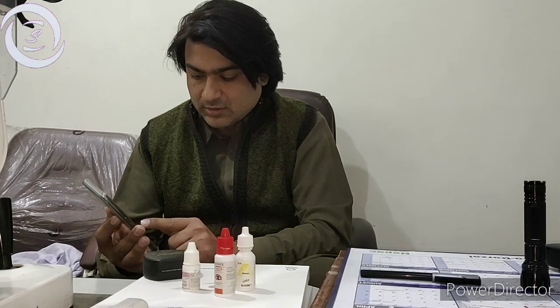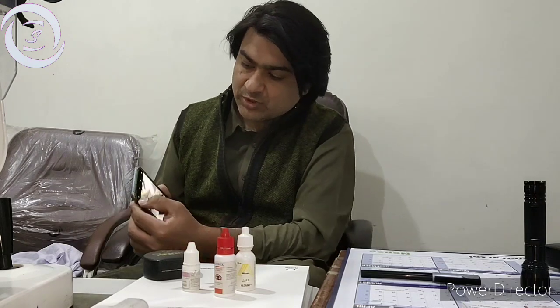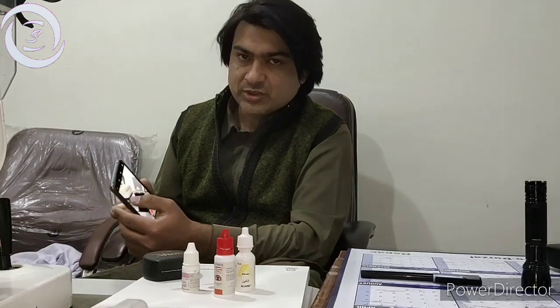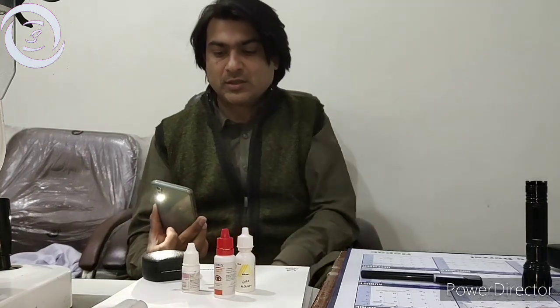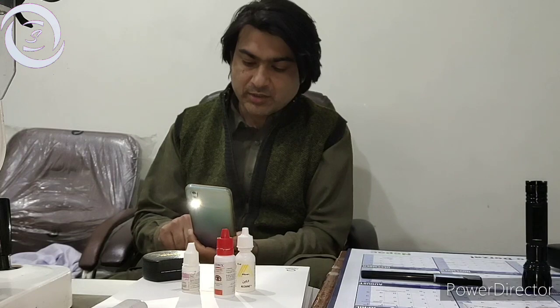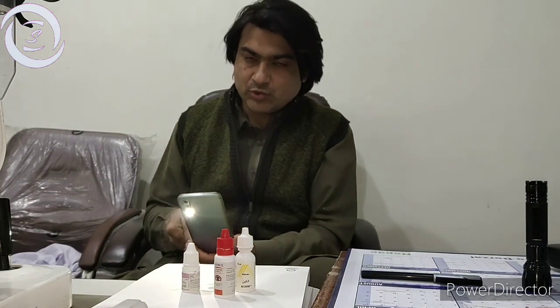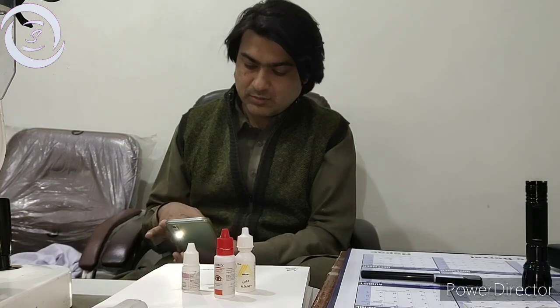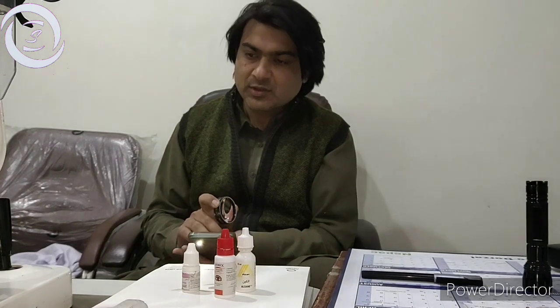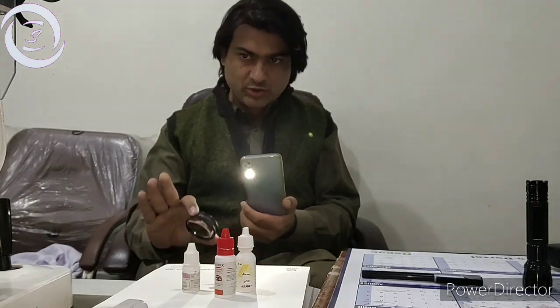Go to the camera, go to picture settings, and make it video. Then you can see we have the flash on. You have to keep the smartphone in the left hand and keep the 20 diopter lens in the right hand.